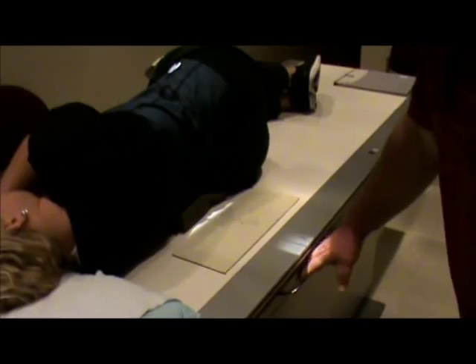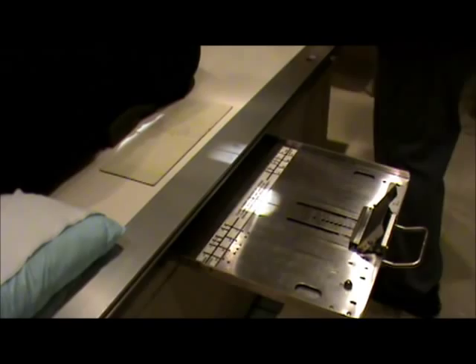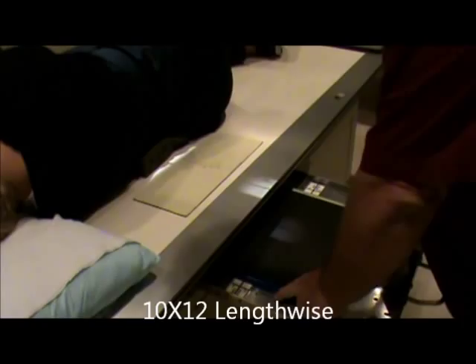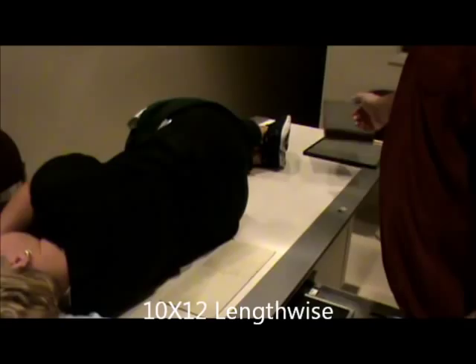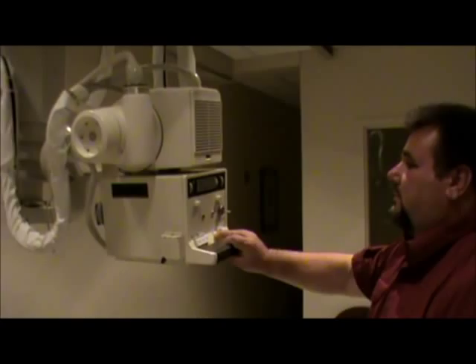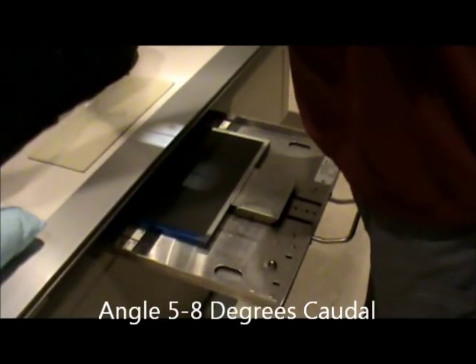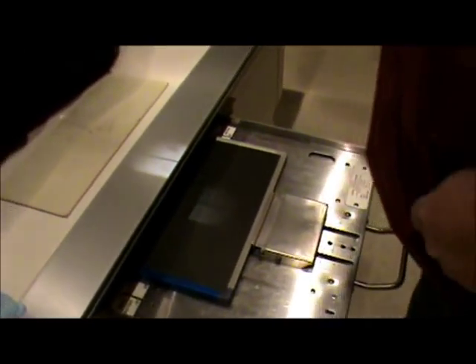We could leave the sponge under for our spot film centering. But I want to show you that in real-world application, sponges aren't always available. So if you're doing this and the sponges aren't available, we can angle about 5 to 8 degrees caudal. Then make sure you re-center to your film — very important. Make sure you're still center locked.